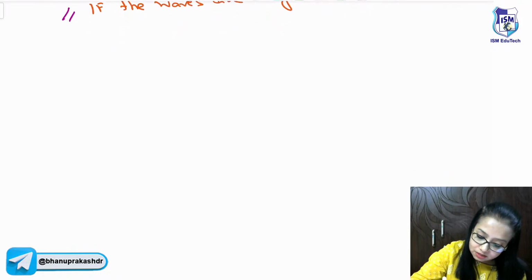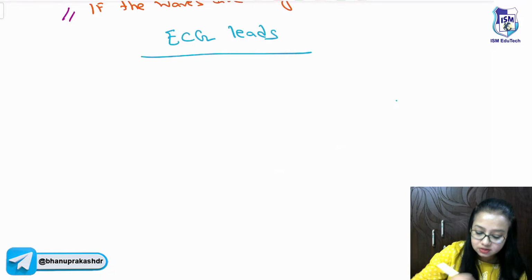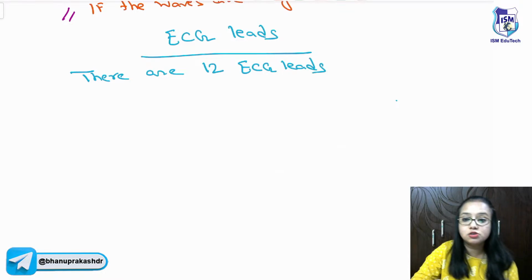Now, coming to the ECG leads. There are a total of 12 ECG leads.